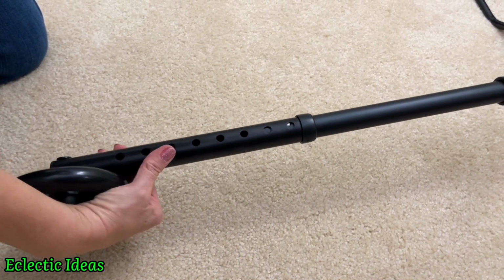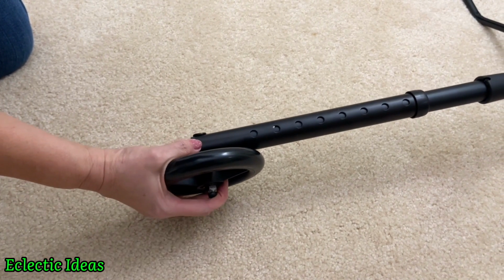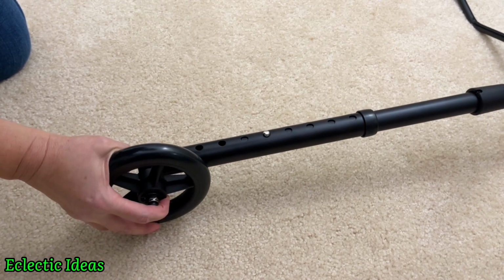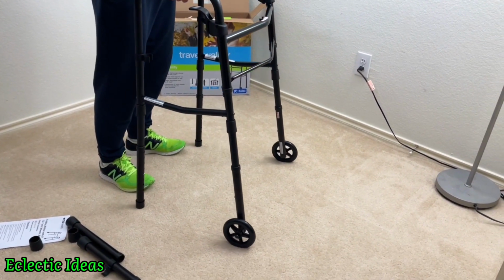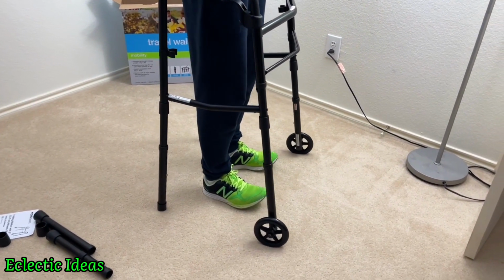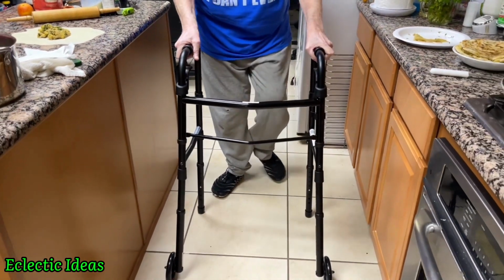We're going to twist it a little bit. You can notch it all the way down like so, or bring it back to the middle and snap it in place. Ta-da! And baby, you're ready to roll. We've got the back glides on and the front wheels on, and there's no stopping us now. Just go slowly so that you don't slip. And here's an example of it going down a narrow corridor with the greatest of ease.